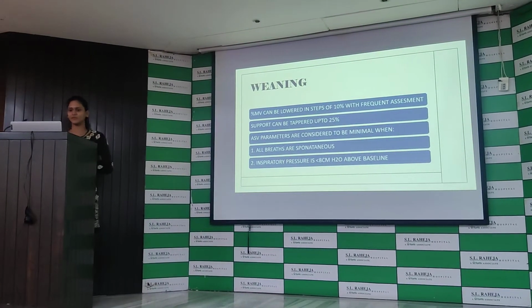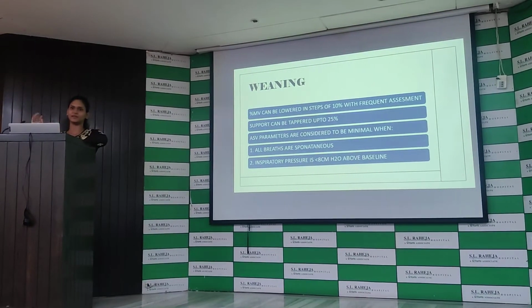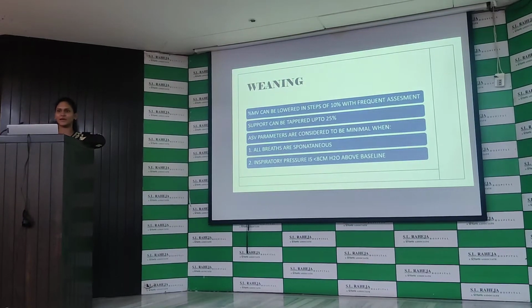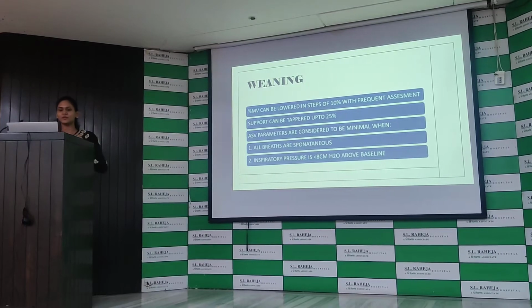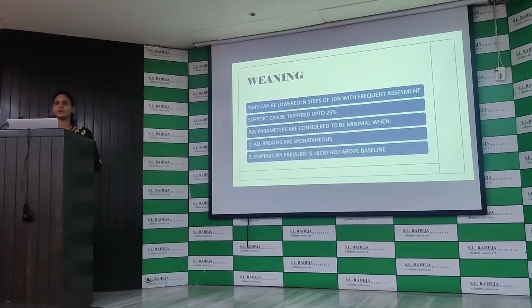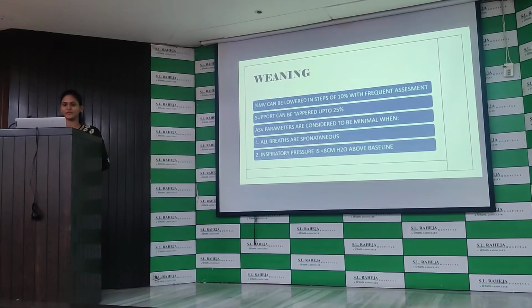When we want to wean, we can use this ventilation from start to end, whether the patient is spontaneously breathing or paralyzed. We can use it until the weaning. So the minute ventilation we now have to lower in steps of 10% with frequent assessment, and the support can be tapered up to 25%.